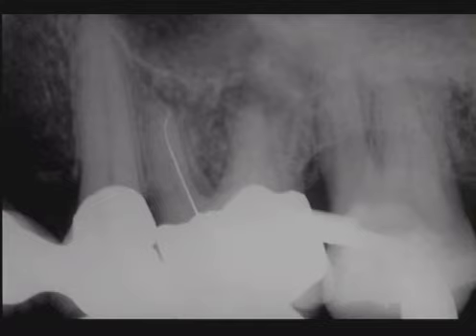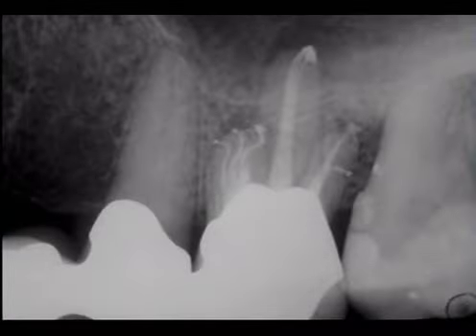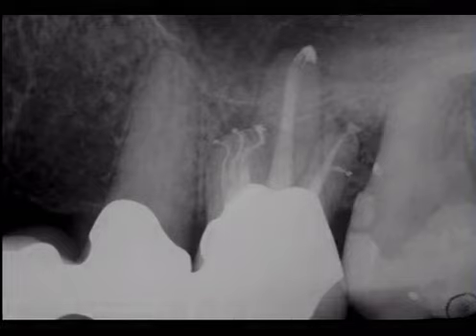A pre-flared canal allows a small-sized file to slide through multiplanar curvature and to length. Notice the furcal side concavity. It's exciting to look at a post-operative film when we've completely followed and fulfilled the mechanical objectives for cleaning and shaping canals. Notice the recurvatures, the bifidity, the lateral canal, and the multiple apical portals of exit.